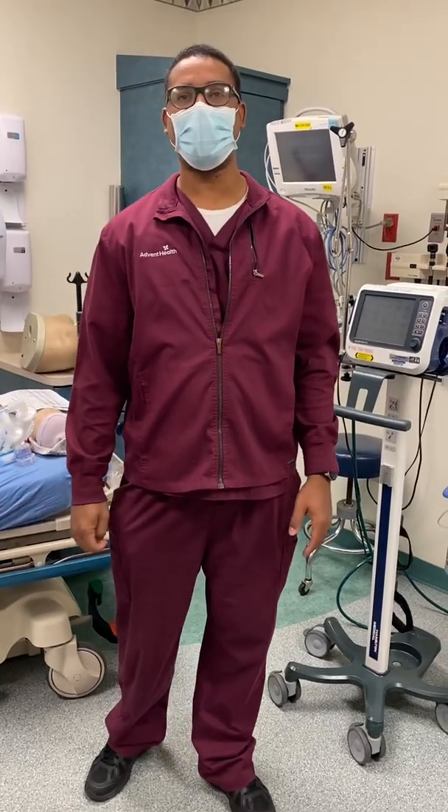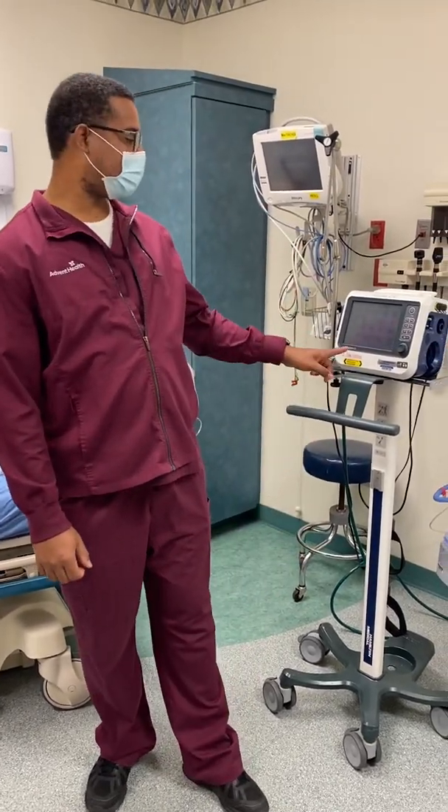Hello everyone and welcome. My name is Rafik. I'll be showing you how to set up the Hamilton C1.